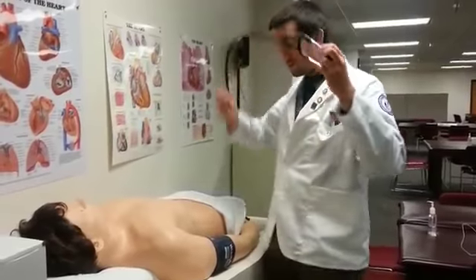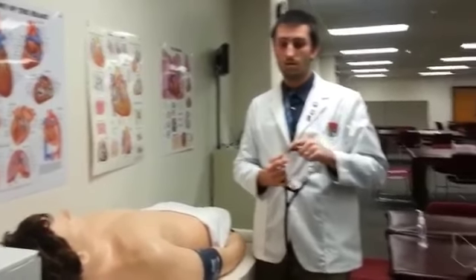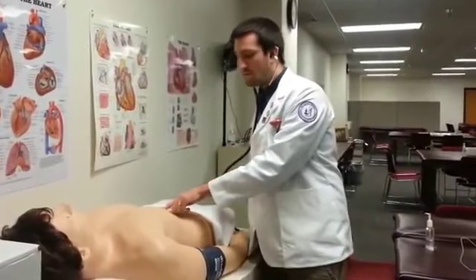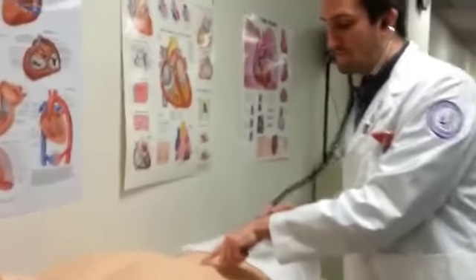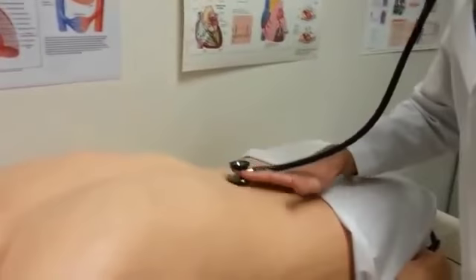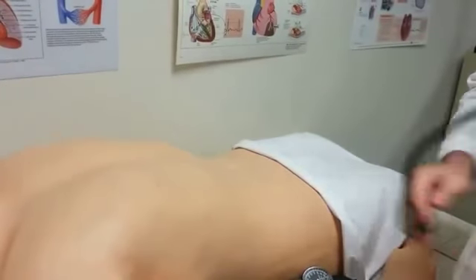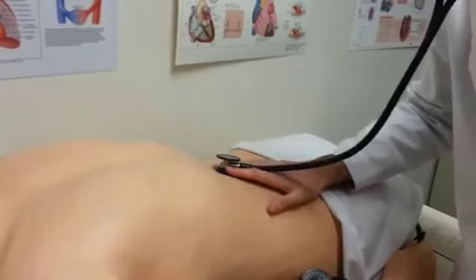Next, I'm going to move on to auscultation of the abdominal aorta. To find the abdominal aorta, I'm going to find the umbilicus and move slightly to the left of it. I personally like to use the bell of the stethoscope because it can help pick up the aortic sound.